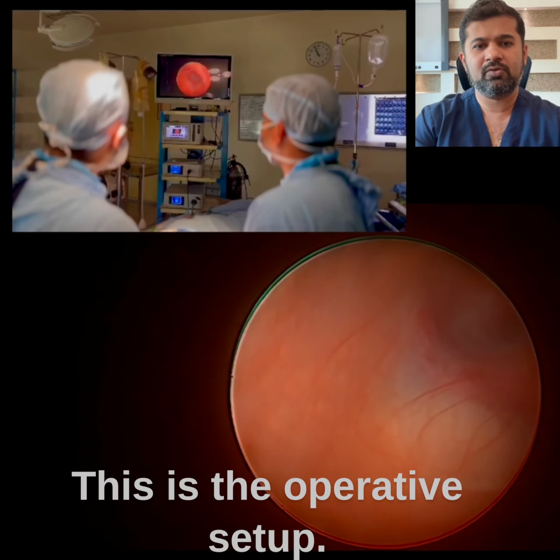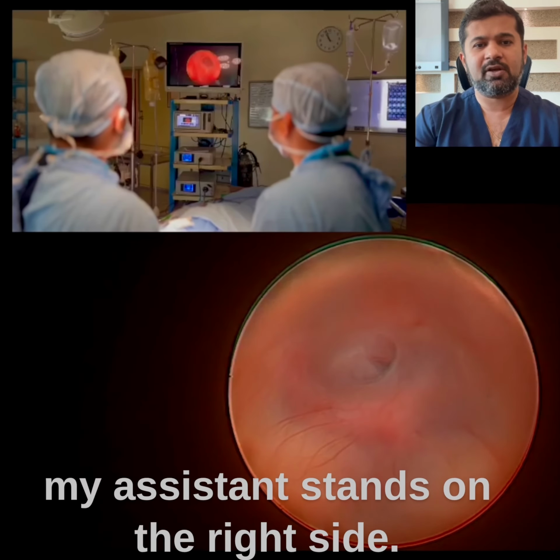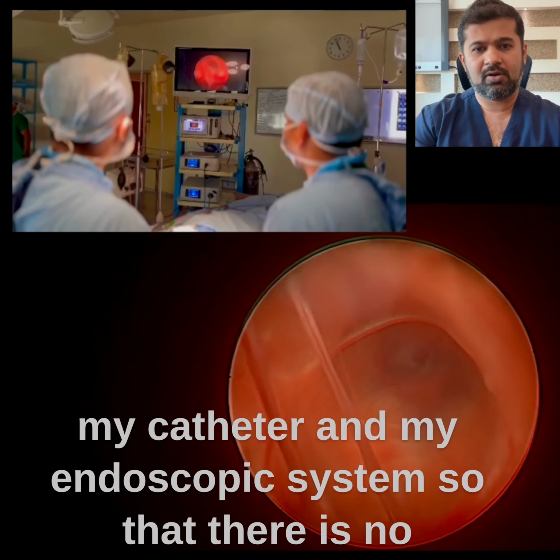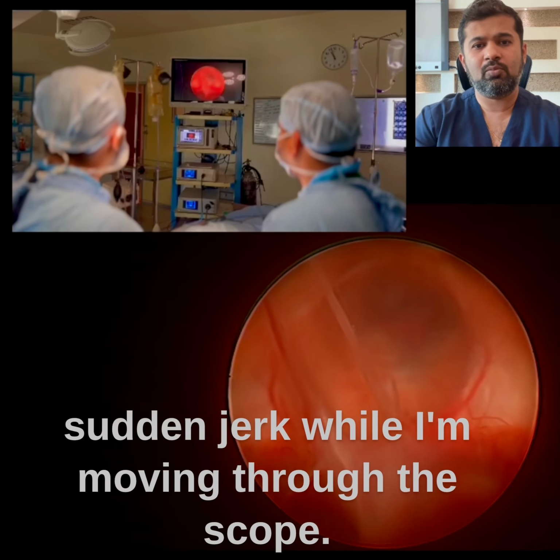This is our operative setup. I stand on the left side while my assistant stands on the right side. It is important for the assistant to hold the elbow of my catheter and my endoscopic system so that there is no sudden jerk while I am moving through the scope.